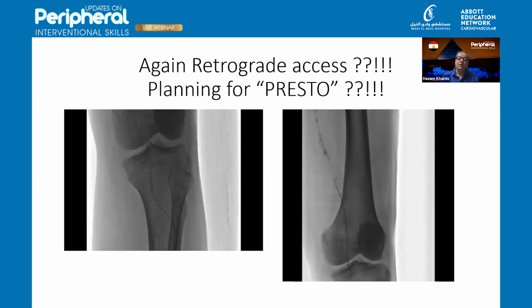Yeah, this is the option. You will put a stent in the common femoral, in a calcified lesion, in the groin. So do you think the Supera is the best option for this case? Yeah, the Supera, not by chance, we name the Supera stent a mimetic implant. Mimetic because you really respect the original anatomy of the artery. We are speaking about bending zones where we have a lot of calcium in the vessel wall. For this reason, the radial force exerted by the Supera stent at the moment is absolutely unmatched.